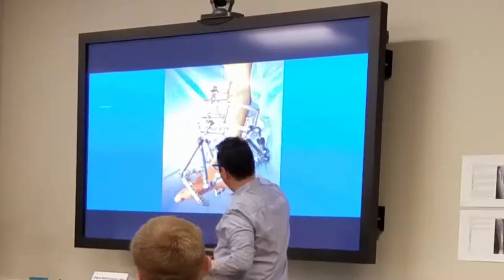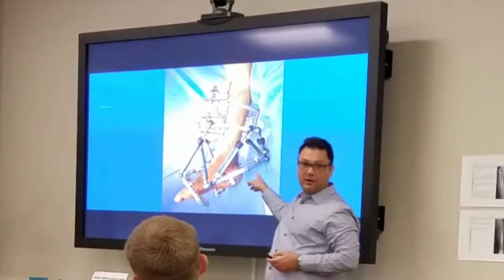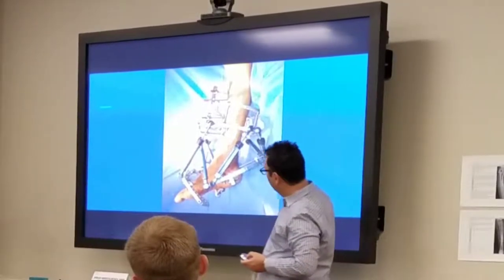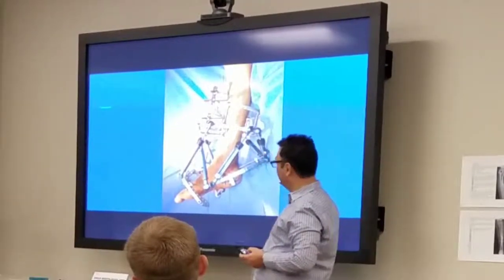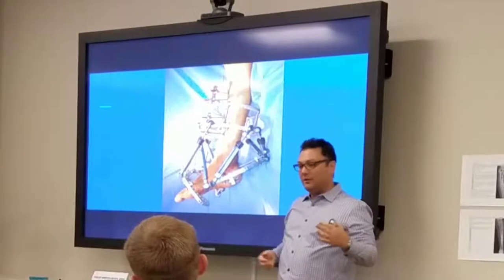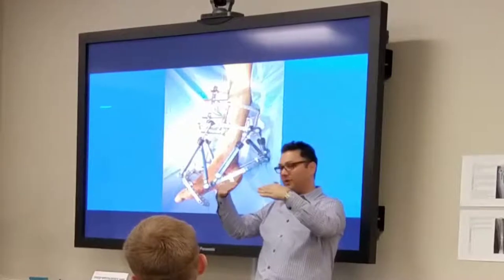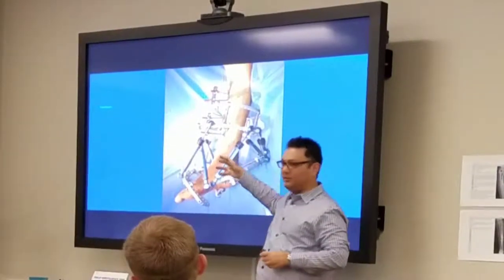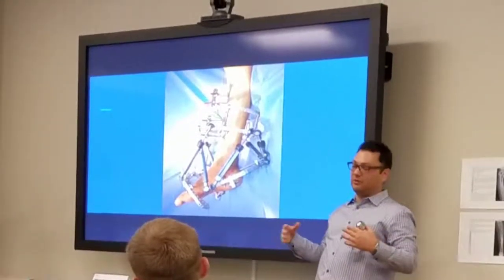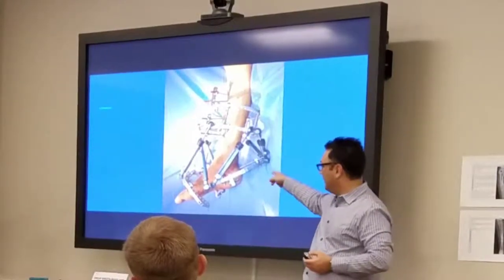So you see over here, and that's where I had this discussion with Dr. Lalonde yesterday. This is like a classic case where I'm going to use a half pin in the heel for that amount of correction that I need. So that's going to really just guide that down. I will not do this approach again, because Dr. Alex over there showed us that there's actually better ways, coming in from the side instead of straight in from the back, because you can get rotation on that. But I definitely would suggest in these kind of big equinus cases on an adult, divergent half pins coming in from the two sides. That's from back over there.